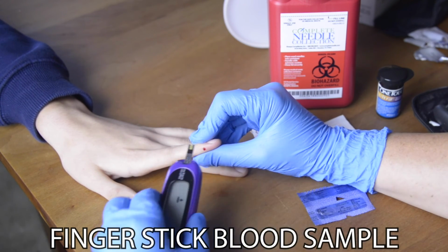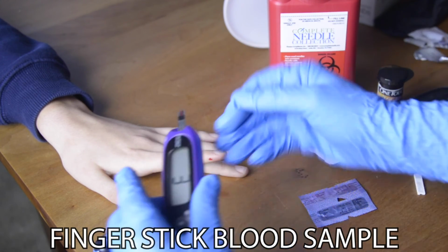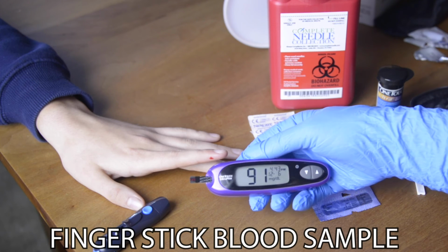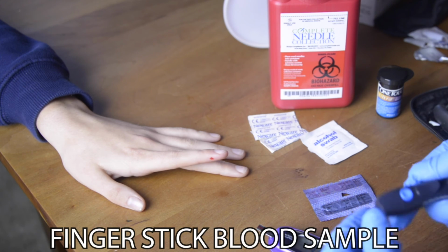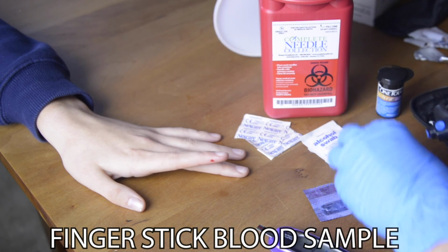Too small a drop and we will not get a sufficient sample. That's a good one. Sharps.